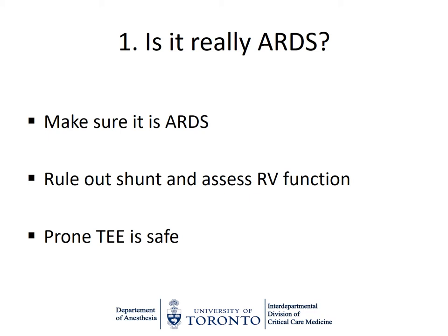So just to summarize on this first point, echo is an integral part of the diagnosis of ARDS. You need to make sure that you rule out a left-sided disease, and it's also crucial to rule out shunt and assess RV function. And if you have to perform a TEE in the prone position, it's been shown to be actually very safe.